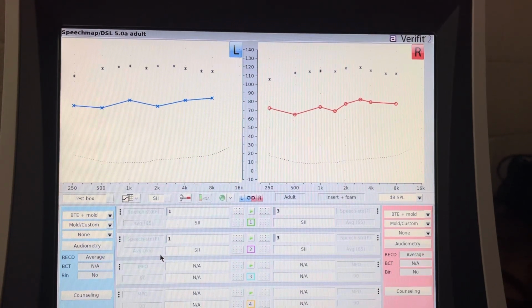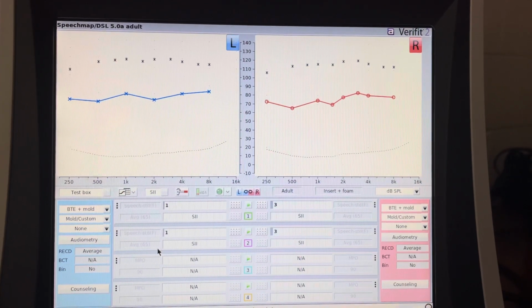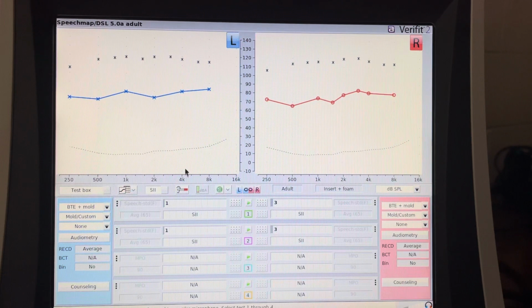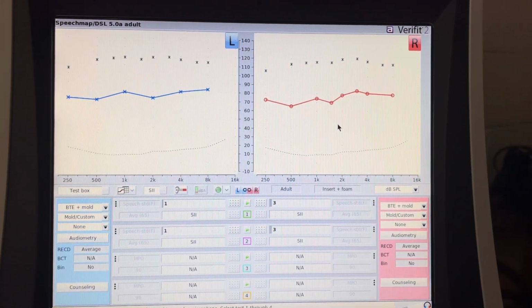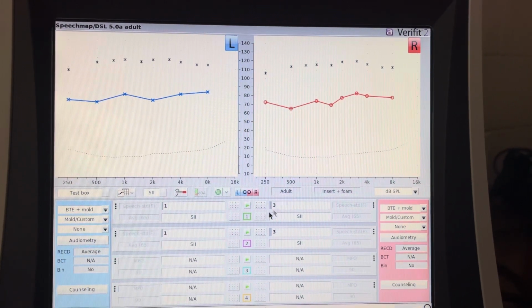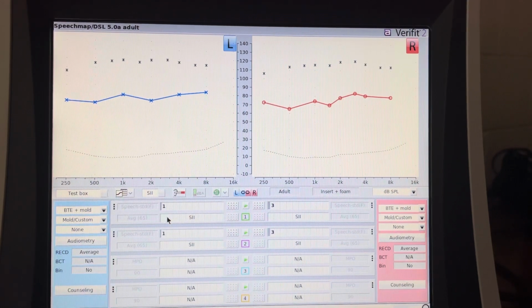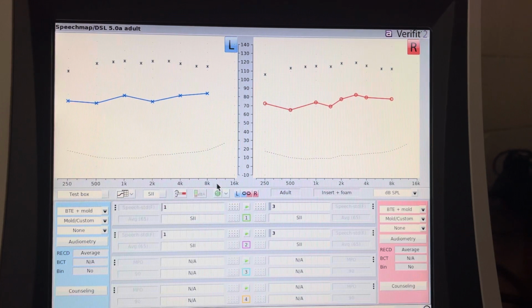Okay, I'm hoping this simulation of her hearing loss will help everyone understand what her hearing is like. So first of all, I have input her hearing thresholds from her most recent hearing test, which was April of 2023. And this computer calculated that when she does not wear a hearing aid, she hears 1% of speech sounds in the left ear and 3% in the right ear.